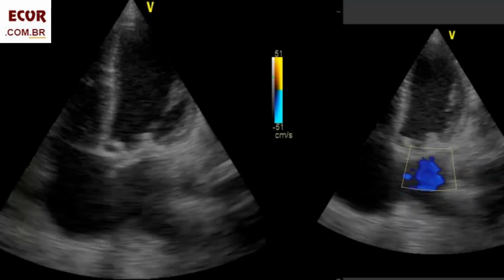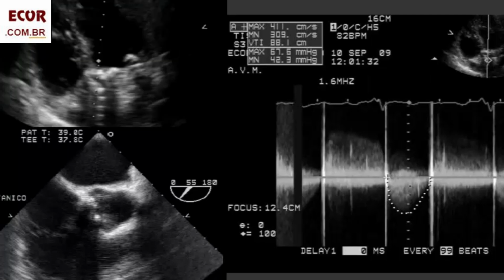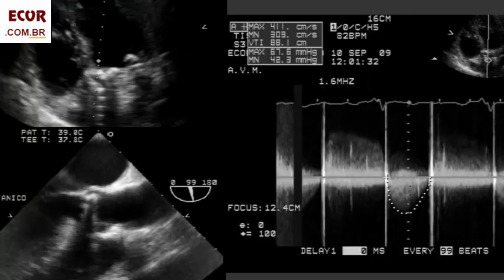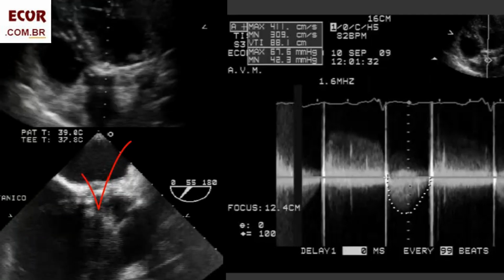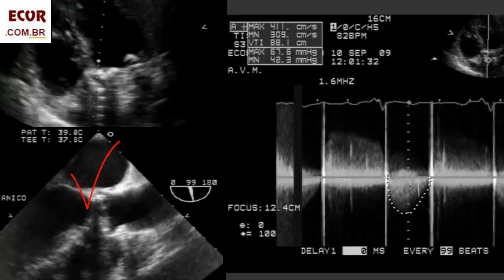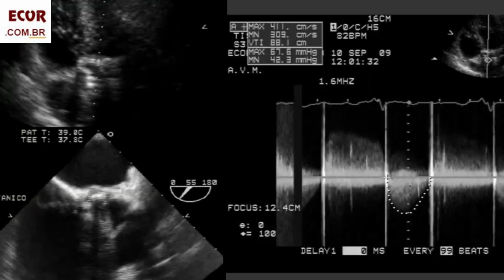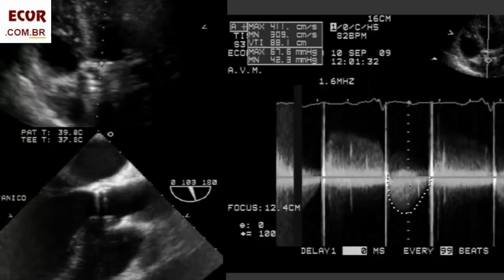Obviously, a transesophageal echo is indicated for better assessment. Here, a single tilting disc prosthesis in aortic position with a mean gradient of 42 millimeters of mercury. Then it's dysfunction. TEE does not show any thrombus. There is some motion of the disc, and right here, close to the sewing ring, appears to have a denser structure that is much longer than just the sewing ring, and with borders that look a little rough. Close to the ring, there is also a small round structure, very dense.